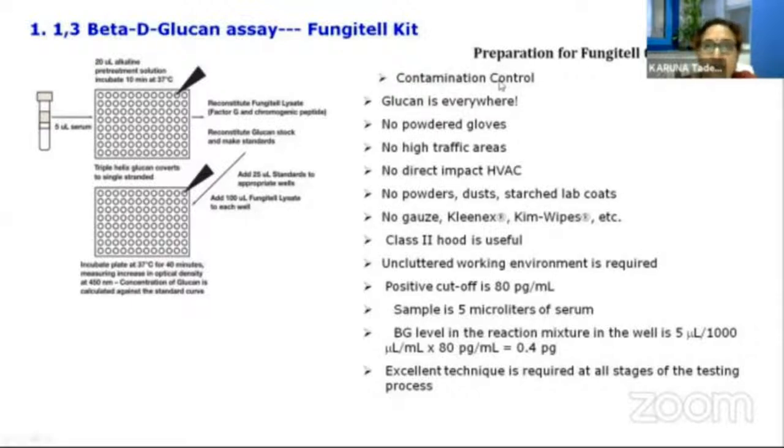The serology room for fungal diagnostics has to be completely separate. Fumigation and all these steps for contamination control have to be thorough. Glucan is everywhere. That is what we have to think.